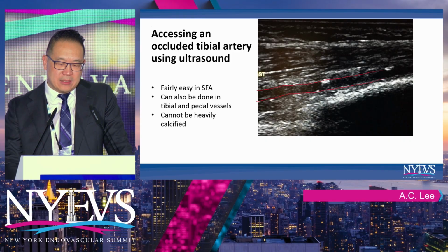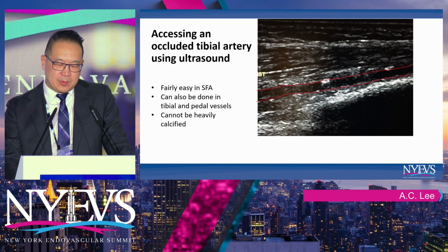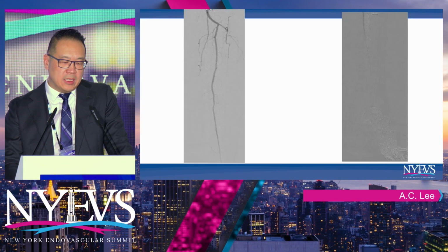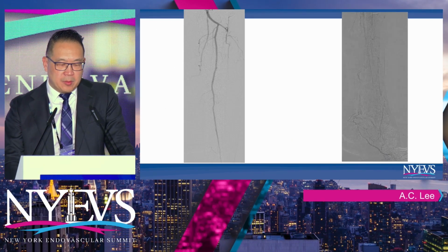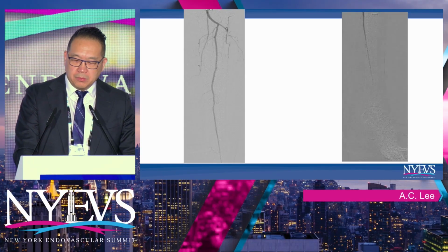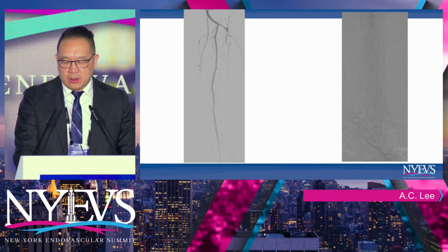You want an artery like this. This is a dorsalis pedis of a patient. You can see some of the calcium flecks, but in general, the lumen, even though it's occluded, is dark. So here's this case. You can see a peroneal runoff. It comes back sort of in one of the plantar arteries, but really nothing in the dorsalis pedis.